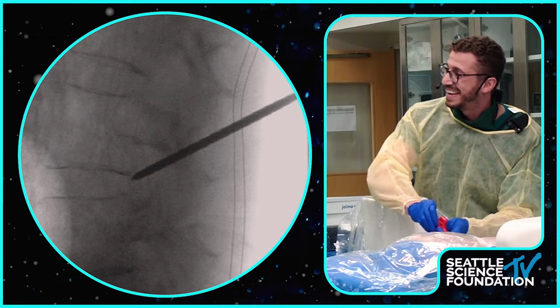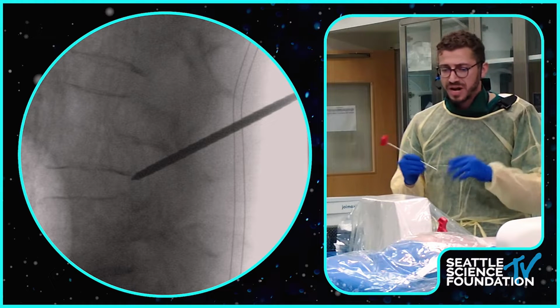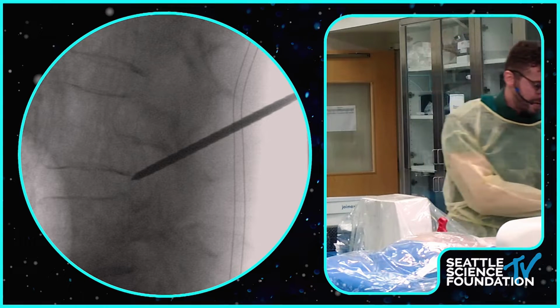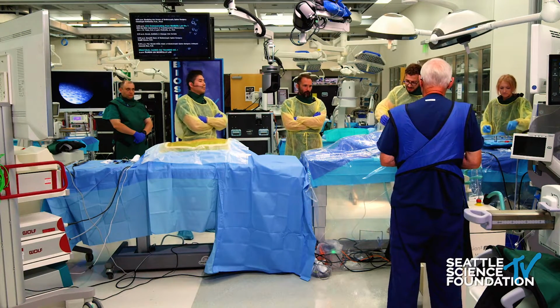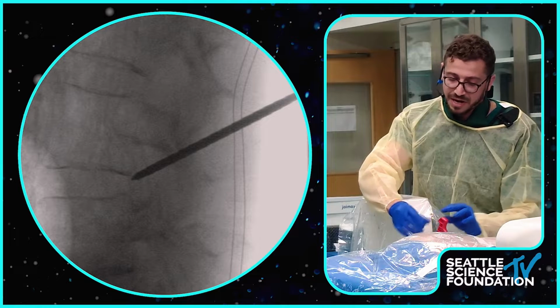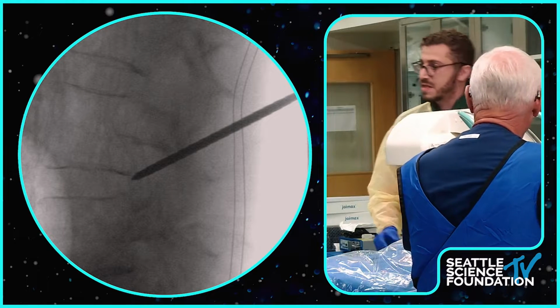And do you monitor the nerves during this part? Absolutely. We monitor nerves now. Part of this ESRG, we're trying to see if we need to monitor or not. But for now, most of us are monitoring, just to make sure that you're not injuring the exiting nerve root. But again, especially if you're doing the trans-SAP approach, that might not be necessary. Okay, so now can you come back to an AP, please? Let's just check to make sure that we didn't slide out or anything.